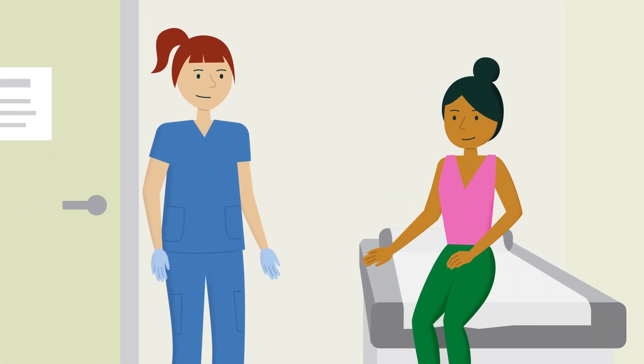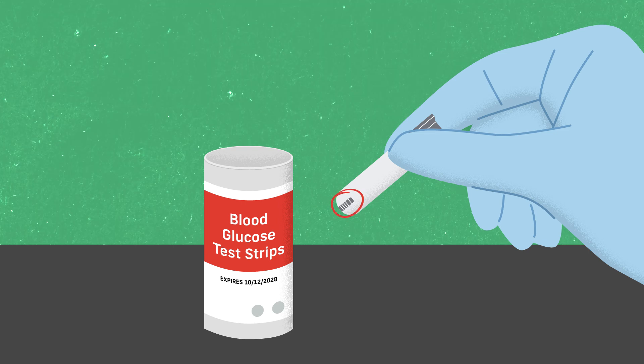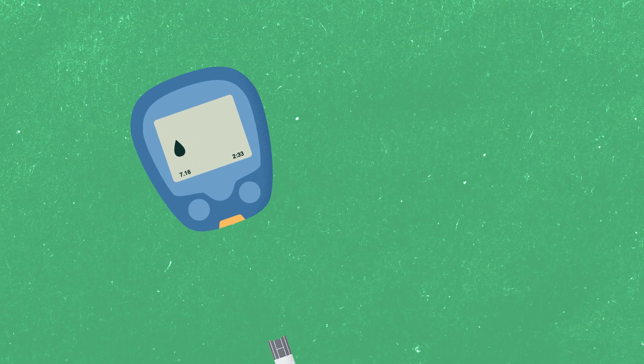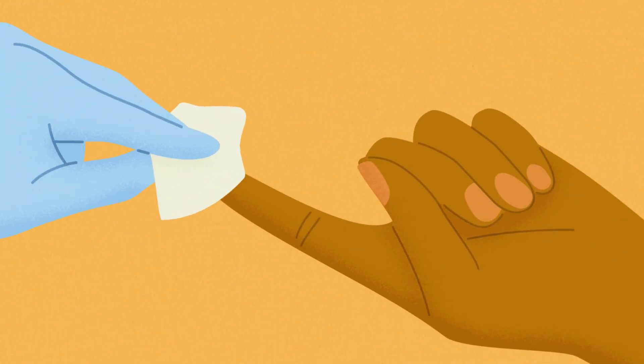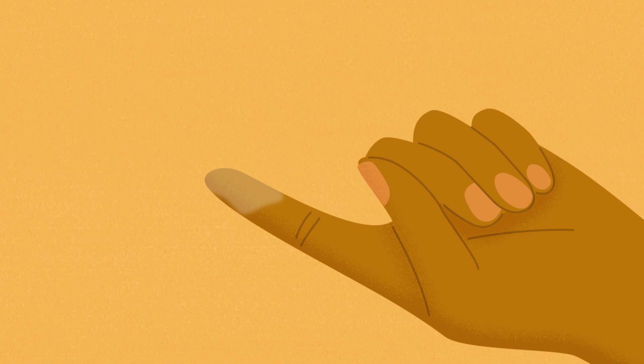Now you're ready to test the blood glucose levels. Confirm the patient's ID using two identifiers: full name and date of birth. Carefully remove a test strip from the container without touching the test pad portion of the strip. Re-seal the container and insert the strip into the glucometer. Set the meter according to the manufacturer's instructions. Then choose a puncture site, and with an alcohol swab, disinfect the puncture site.